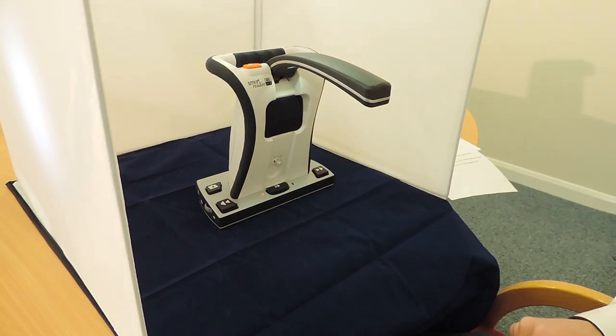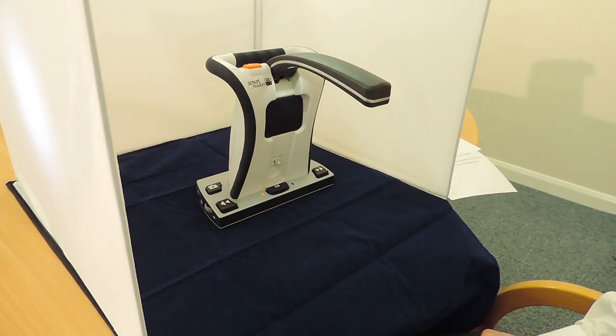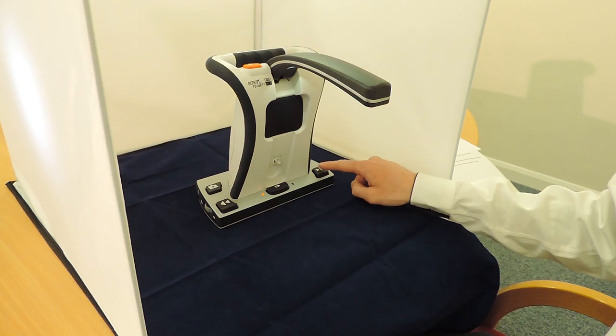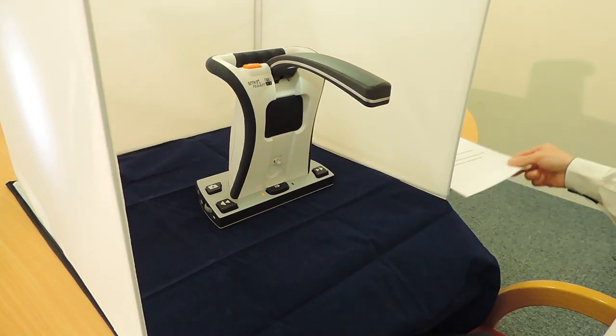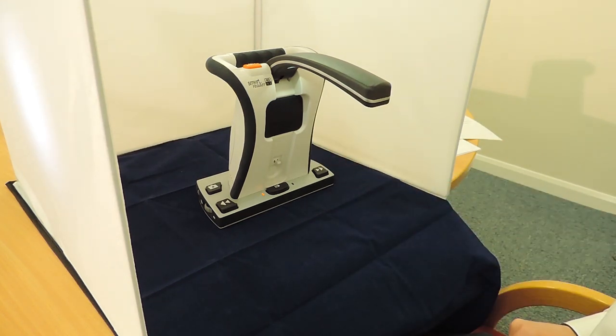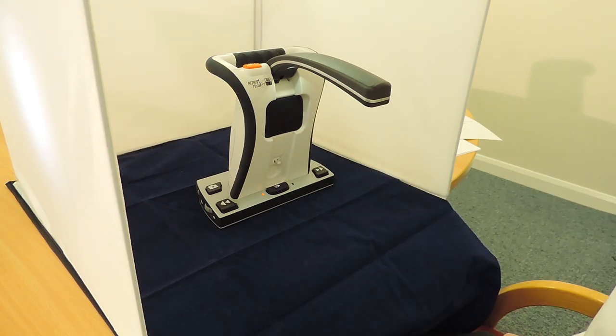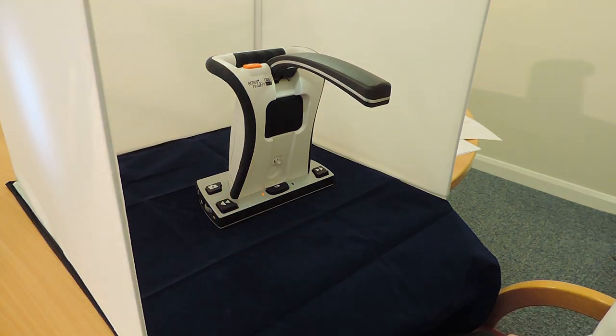On the base of the unit in the centre, there's a button that you can tap to play or pause during reading at any time. On the base of the unit, there are also two buttons located towards the front on the left and the right side — these are the previous and next line buttons. By pressing the next line button, the document will be moved forward to the next line, and likewise with the previous button: press this to move back a line at a time.